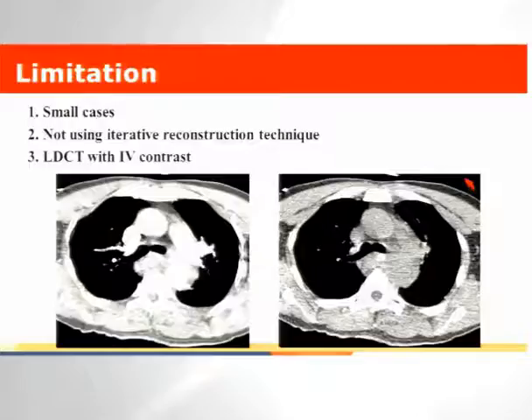There are several limitations in this study. First one is small number of cases. Secondly, we did not use iterative reconstruction technique. As we know, this technique could reduce radiation dose and artifact. And third is about contrast enhancement.